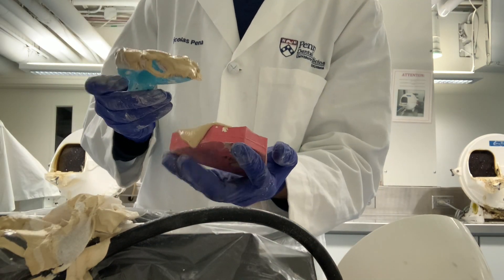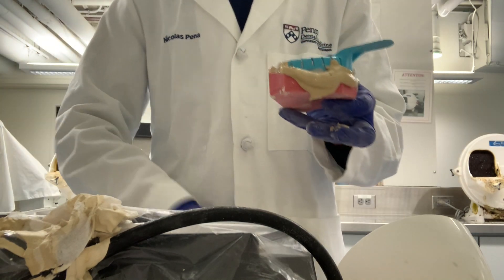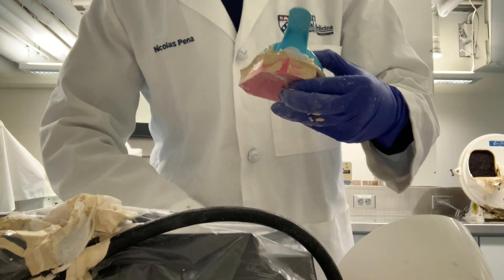We then get our plazdent models, apply a full coat of cast material, and sandwich them with our impressions. After wiping off the excess, we let our cast sit for about 45 minutes and we're pretty much done.